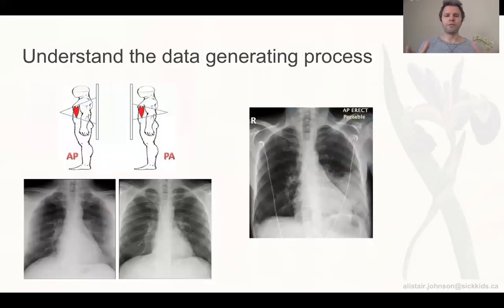And again, it's very important to understand the data generating process. So if you actually look at x-rays and medical imaging in general, it's very interesting. It's very, very protocolized. So when you're thinking about natural images, and all the data sets we have of natural images, it's people taking pictures in all sorts of different environments. Objects are rotated, objects are far away, close to you, and there are all sorts of considerations in managing that. But with an X-ray and with medical imaging in general, there is a technician who is trying as much as possible to measure the patient in the exact same way every time.